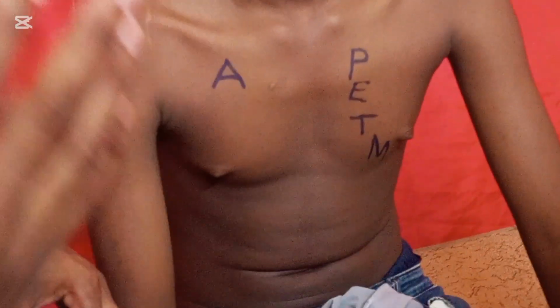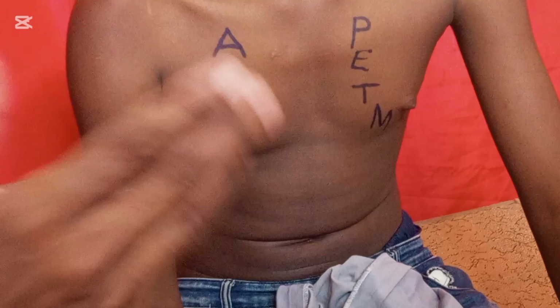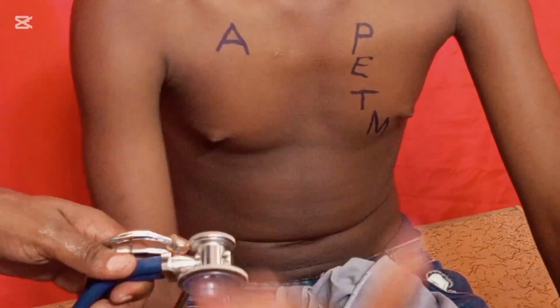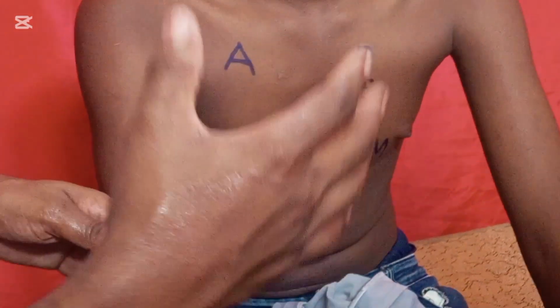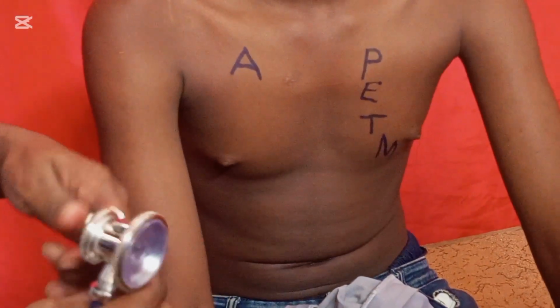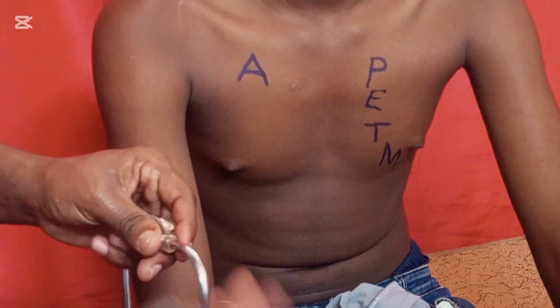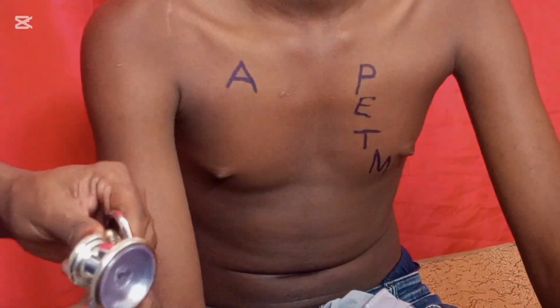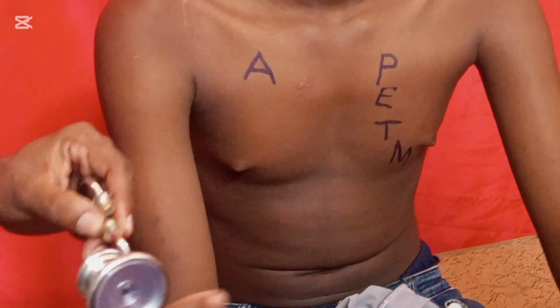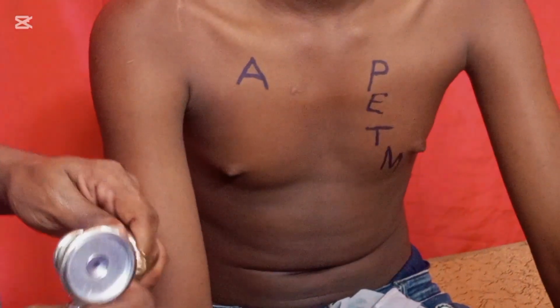Generally we have the first heart sound and the second heart sound, and we have the third heart sound and the fourth heart sound. The first and second heart sounds are the normal heart sounds. The extra heart sounds, the S3 and the S4, are abnormal heart sounds. The S3 heart sound sometimes can be normal and sometimes can be pathological. The S4 heart sound, the fourth heart sound, is generally pathological. It can't be physiological. So that is how you are going to listen to the heart sound.